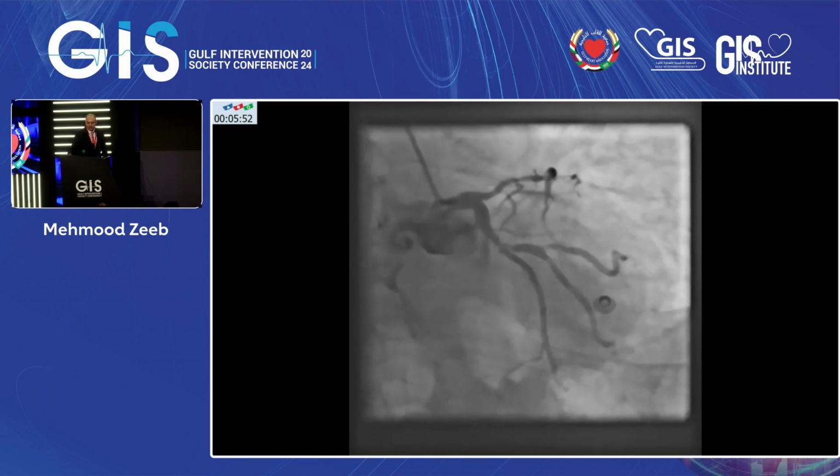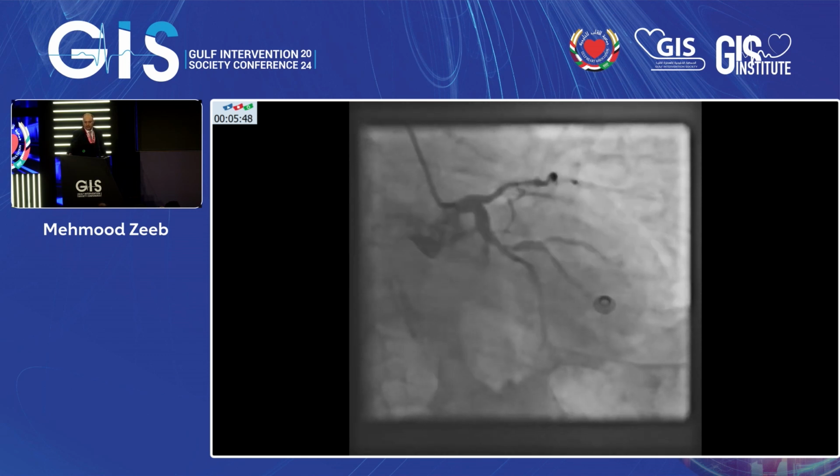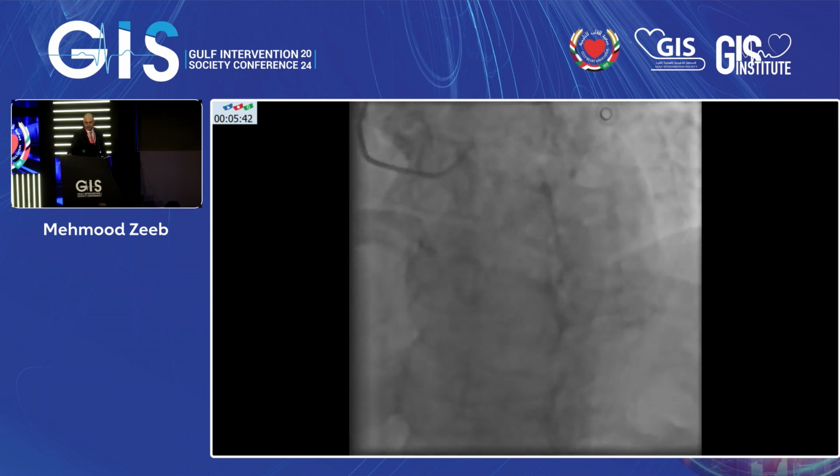This is his coronary angiogram, so you can appreciate the calcification in the proximal LAD, as well as the lesions in the circumflex. I'll just go through the pictures one by one.